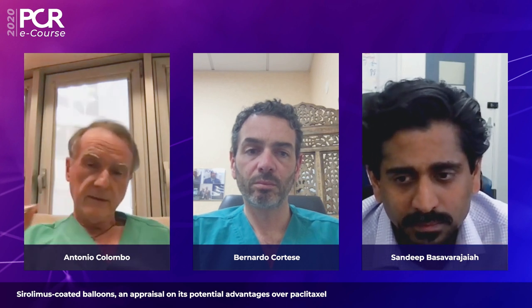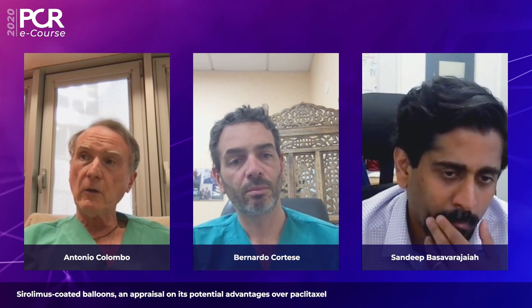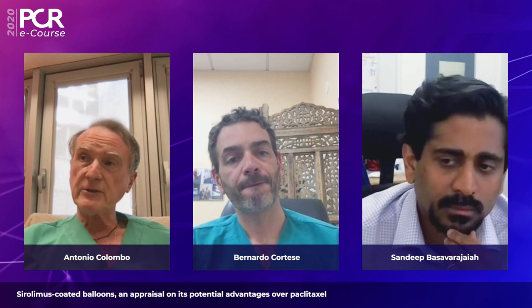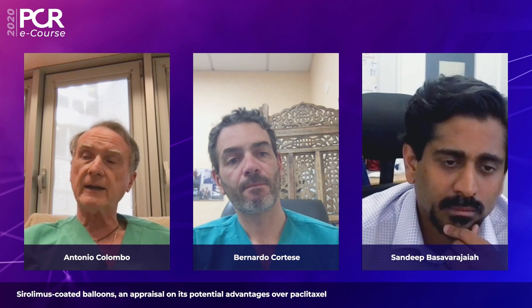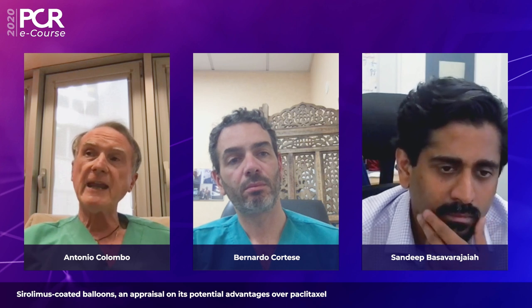No. I think this is something that we have done for years. We published a paper in JACC about focal stenting, spot stenting many years ago. And we also have now long-term follow-up of patients treated with a drug-coated balloon and a drug-eluting stent on the same lesion. There has been a lot of trepidation to use two drugs or to use double dose of the same drug, and we have not seen any long-term adverse event or effect. We didn't see any vessel aneurysm or any risk of late thrombosis, and we have now follow-up over 3-4 years.